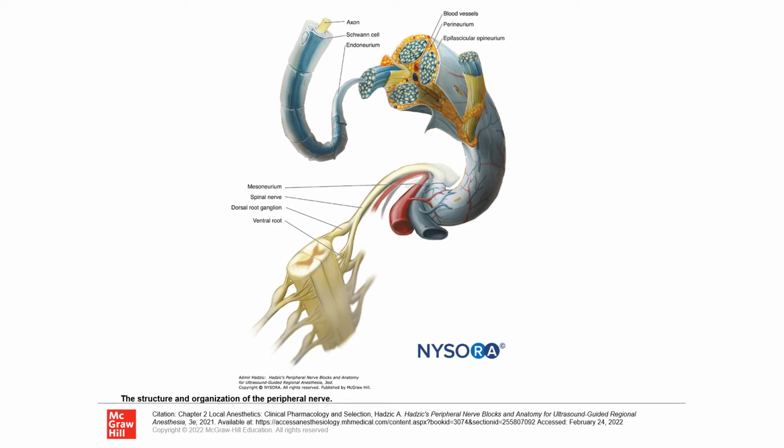The local anesthetic will diffuse from the outer mantle to the inner core of the peripheral nerve along a concentration gradient. This results in nerve fibers located in the outer mantle being blocked first. Outer fibers are distributed to more proximal anatomic structures, generally speaking, than those situated in the core. And as a result, this block will evolve from proximal structures to distal structures.